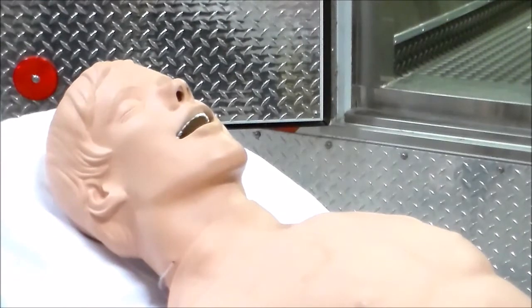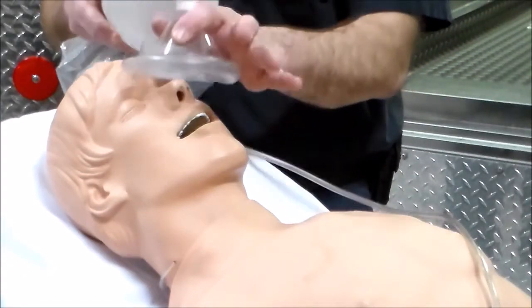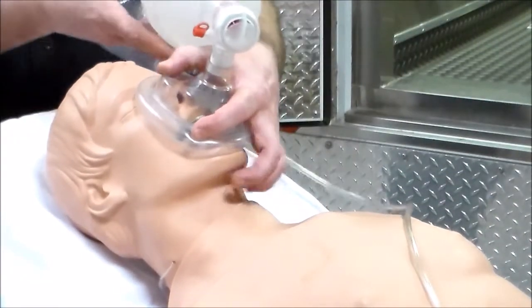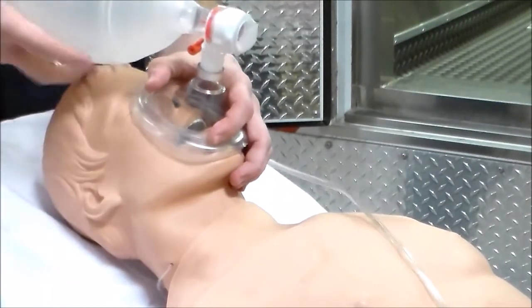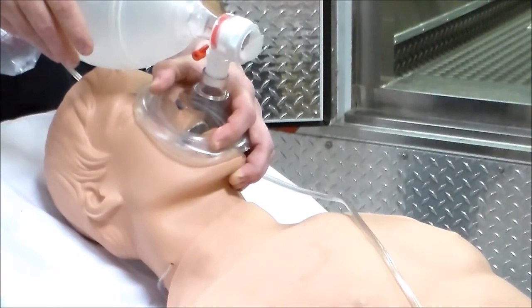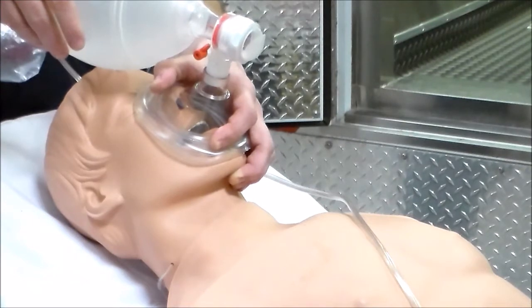For our bag valve mask, we've attached the oxygen. We come in and apply the mask, making sure it is down over the nose and mouth. We apply the CE clamp technique, then ventilate at one breath every five to six seconds. For simplicity, it makes it easier if you just do one breath every six seconds.